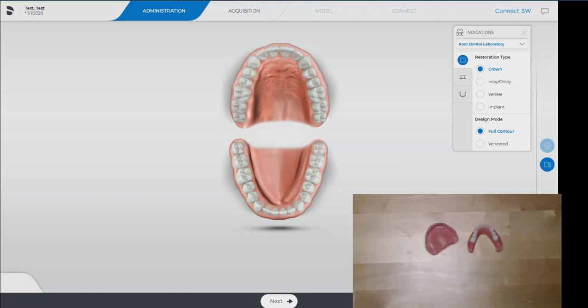Today I'm going to show you how to scan upper and lower dentures into the CEREC software using the Prime Scan. Today we're using the 5.1.1 software. We're in CEREC Connect.